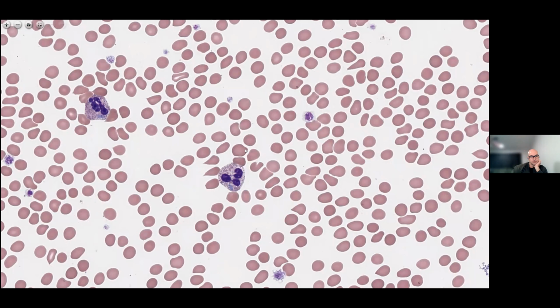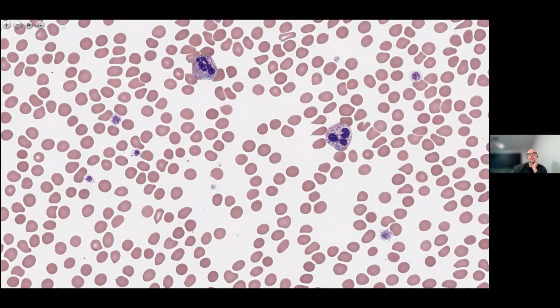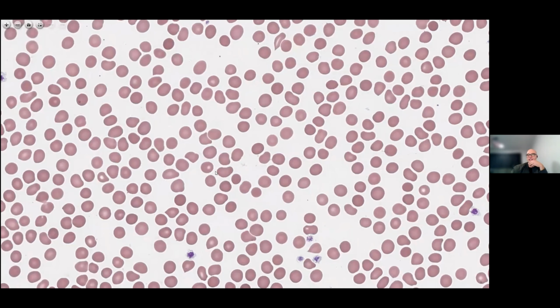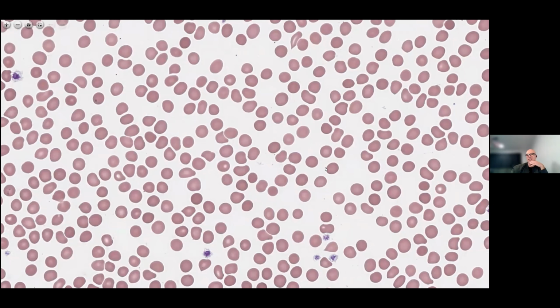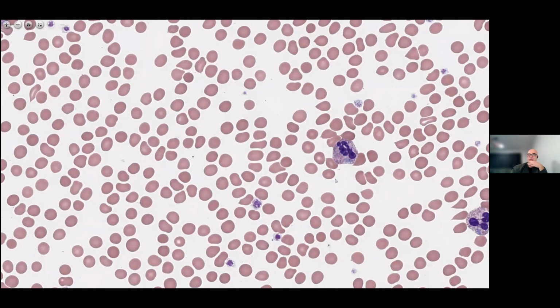We've got one comment asking, could this be gray platelet syndrome? Okay. I mean, I've never seen a case of that. I'm not sure if you have, Joe. No, I haven't. But I've read about it. When we get our quality assurance surveys and you're looking into congenital macrothrombocytopenias, you start reading Barbara Bain's textbooks and other wonderful textbooks about morphology, and you come across these rare congenital conditions.